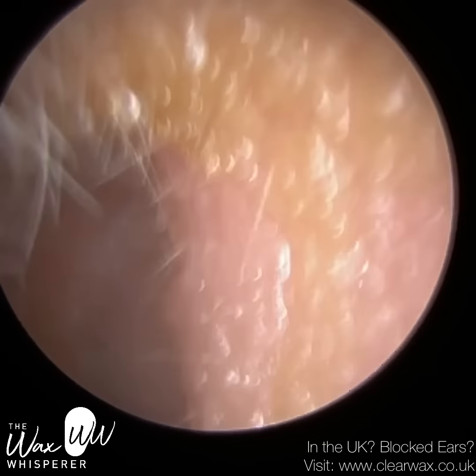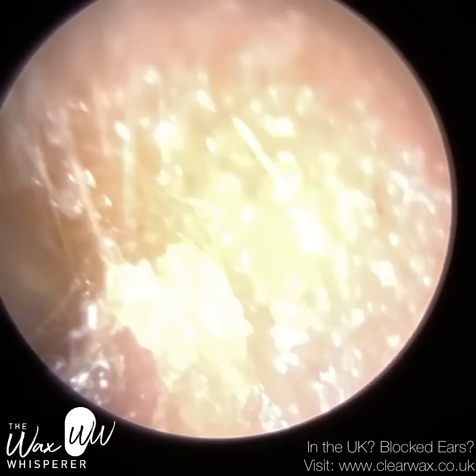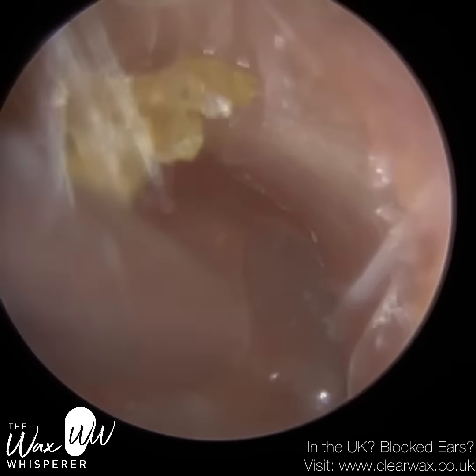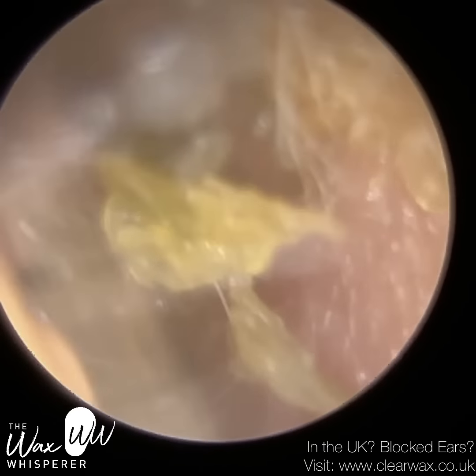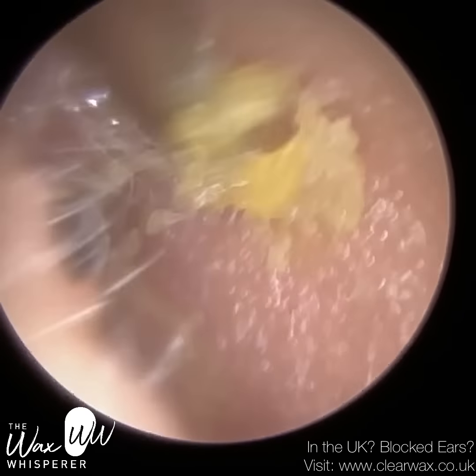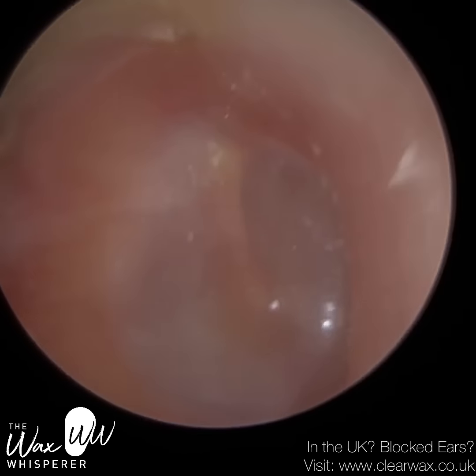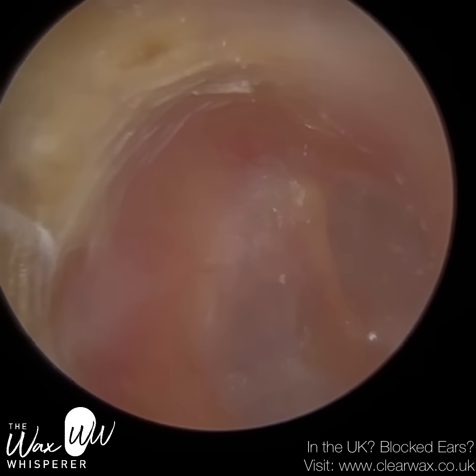And in this view, the moment when I went into the ear, you may have seen just how narrow and slit-like the ear canal is, and that's another good view. So we really have to stretch the ear. So I'm just going to the roof and peeling down. They've got this crusted skin just at the entrance. You can see this region of the ear canal is a bit more red and tender, a bit more inflamed. They have got some medication prescribed from their GP to help with this. The otitis externa, so this kind of psoriasis of the ear canal and eczema.